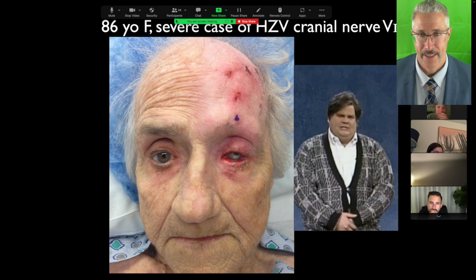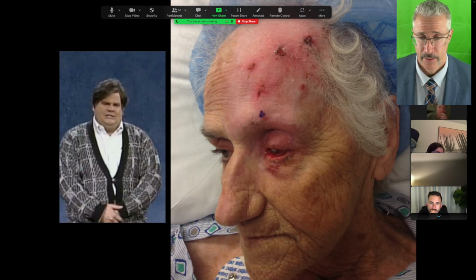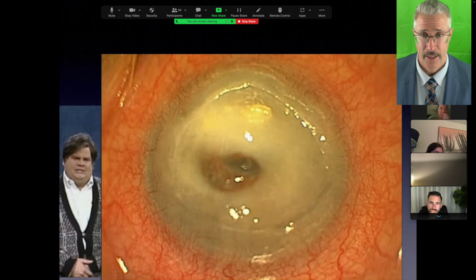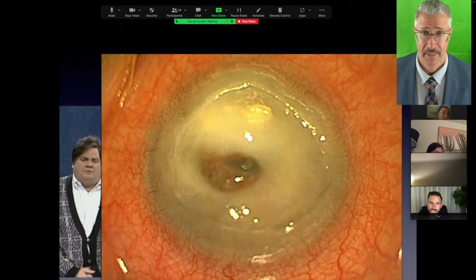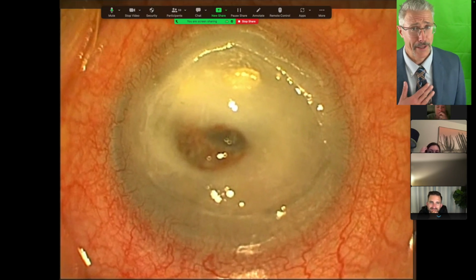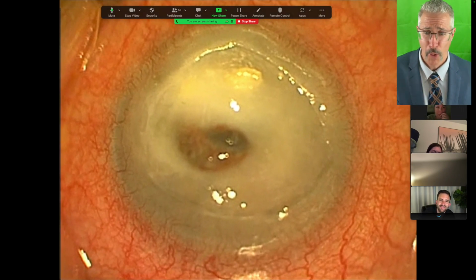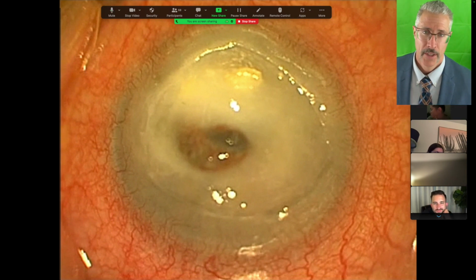Oh yeah, this case. Sequelae. Perforate. Let's look at this cornea. Is it gonna... Oh, man. Sweet mother of God! Good Lord! I agree, Chris. That's a full corneal ulcer. The whole thing's an ulcer, and the iris is plugging this huge spot in the middle.